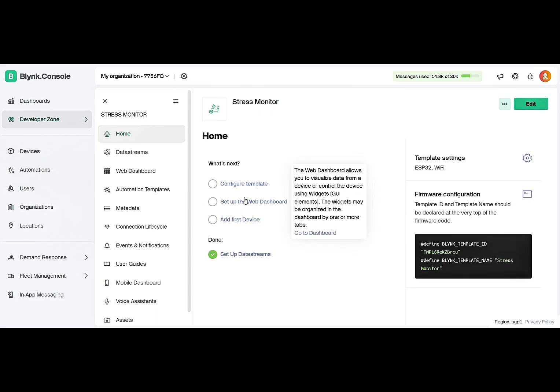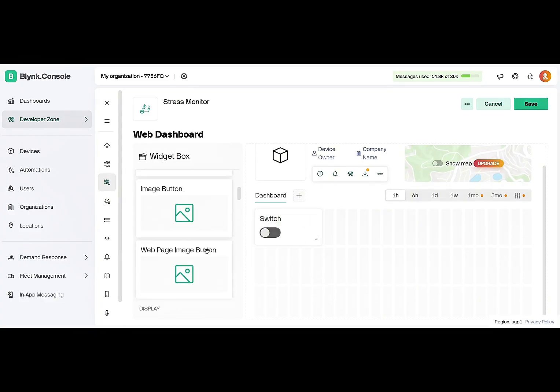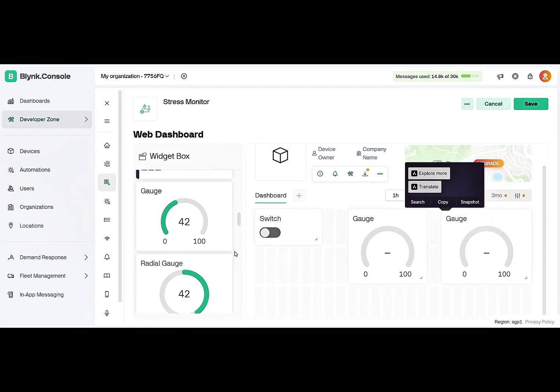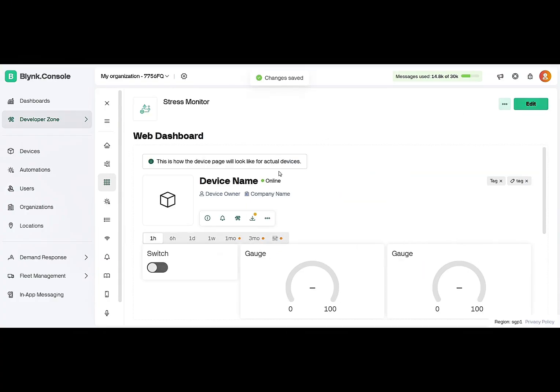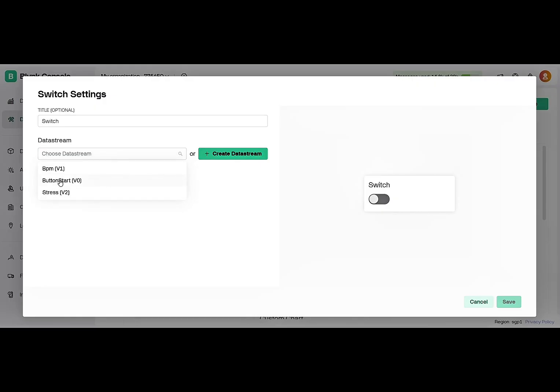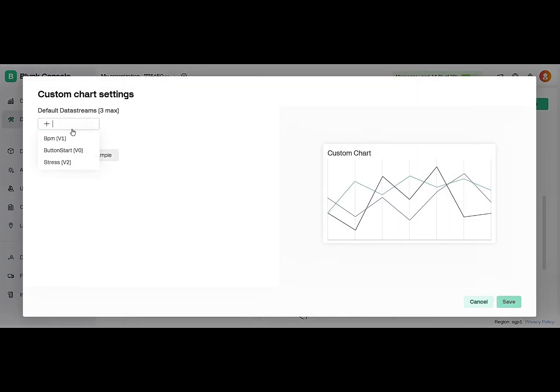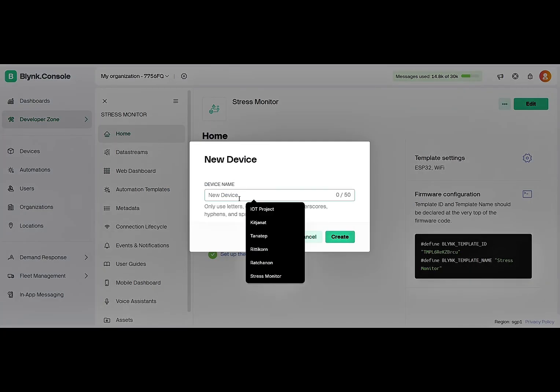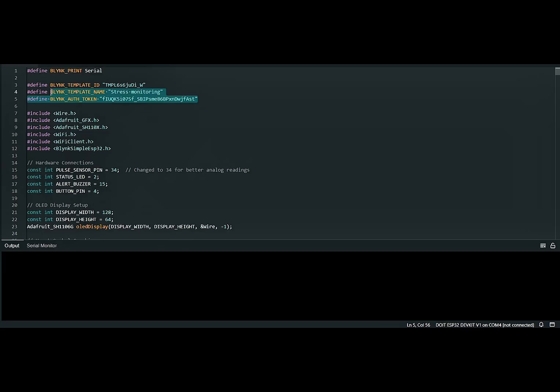Next, we will go to the web dashboard. So we'll create the switch for the button and the gauge for the BPM data and stress data. Next, we will set the data stream for each widget. Next, we set the device name, so we will get the code for Blynk in the Arduino. So place it in the Arduino.